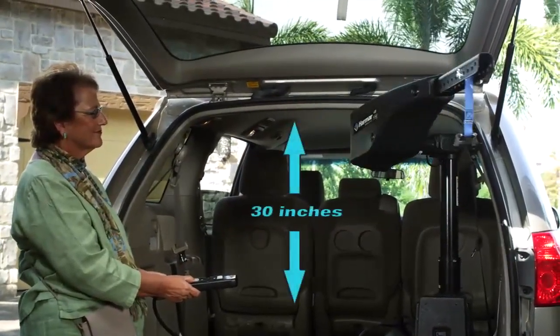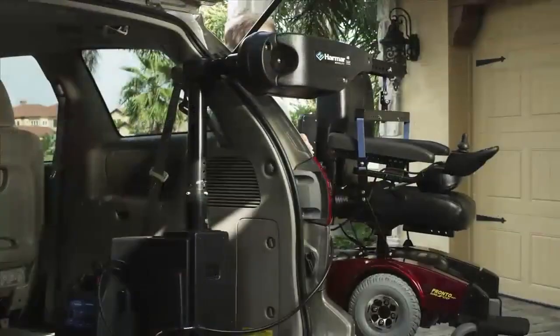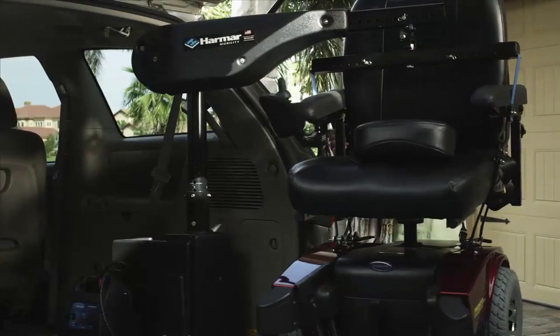This fully powered boom-style lift requires only 30 inches of headroom. It easily mounts inside to work from the side or back of the vehicle. The offset post allows the lift to safely place the chair or scooter off to the side of the vehicle.